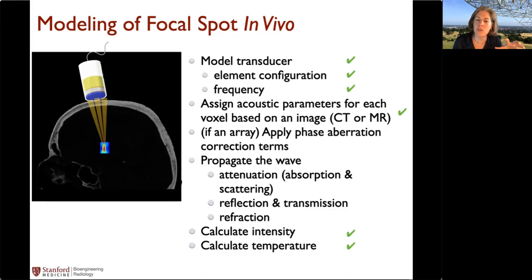But on the other hand, if you take somebody who's a young researcher, maybe Keith, for example, and you say, well, I want to do a neuromodulation study on him, it sure would be nice to not have to get a CT and be able to do something with an MRI, for example. Especially in the future, I think fMRI is going to be a tool that we're definitely going to want to use when we modulate the brain, to look at the fMRI and see what's the effect of what we're doing. So we may already have an MR scanner or be in the MR scanner, so being able to get some of the information from MR could be useful.